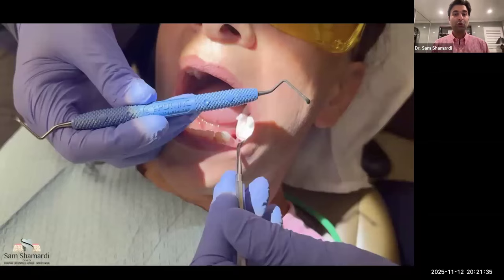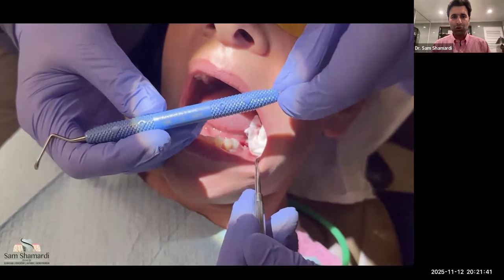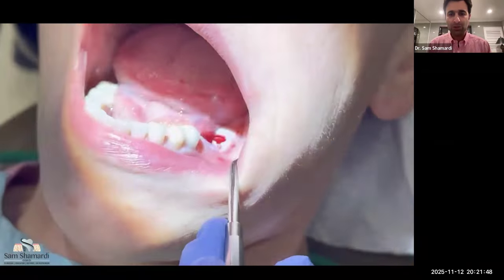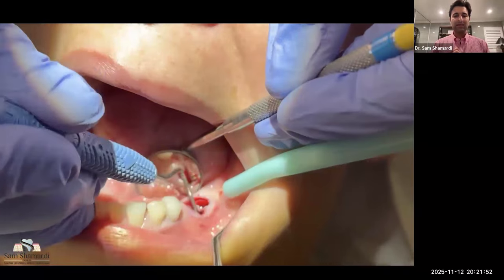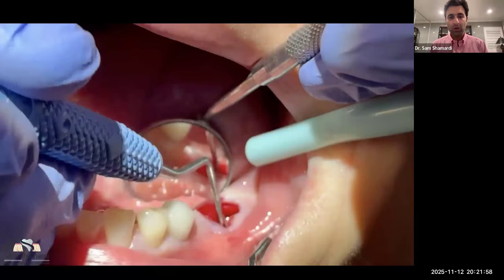Of course, then we have the critical part of doing our curetting that we mentioned. Here's the instrument, and it will be on your free surgical instrument list, but from our friends at PDT, known as a Slade blade. You can see the way we put that gauze pressure in there, leave it, and then we go through the process of spending an extended amount of time making sure that there's no infection left within our socket, which I guarantee you there always will.